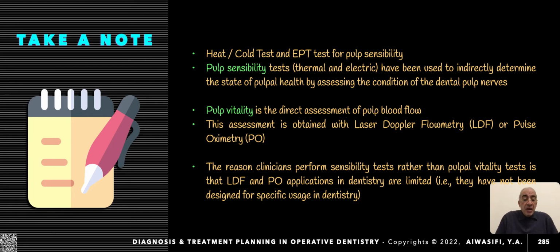Why do dentists in general perform sensibility tests rather than pulp vitality tests? Because the application of these devices is limited in dentistry and they are difficult to adjust specifically for dentistry. They are actually available, but expensive and not easy to use.